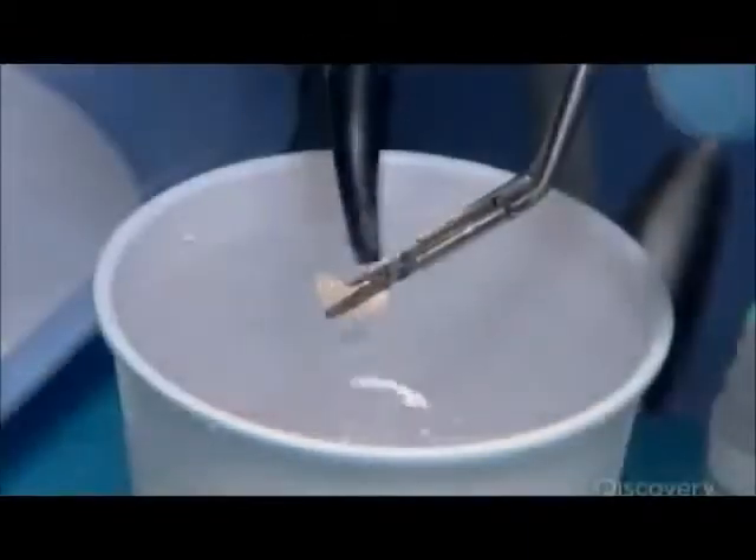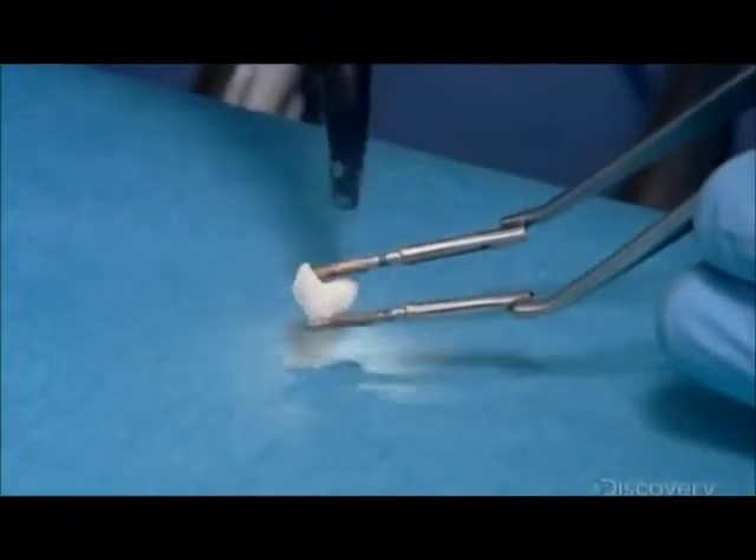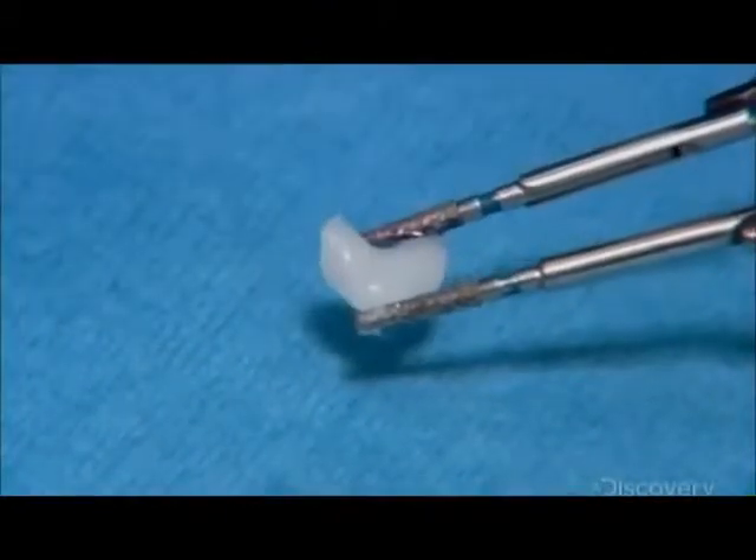He dips the filling in water and the hardened solution flakes off. He then thoroughly dries the inlay. Next, he adds a drop of silane, which will promote the bonding of the inlay to the tooth.